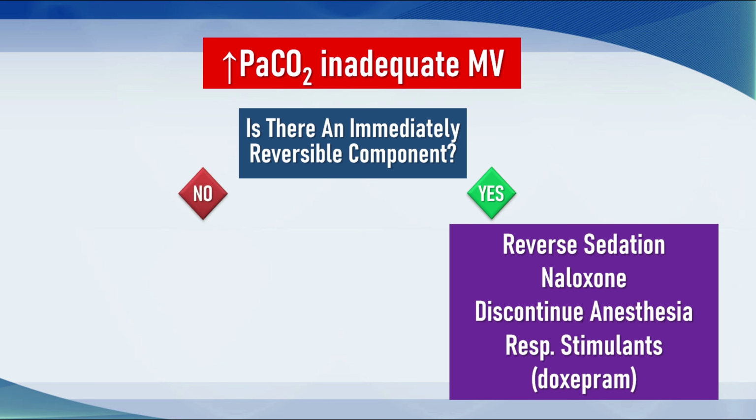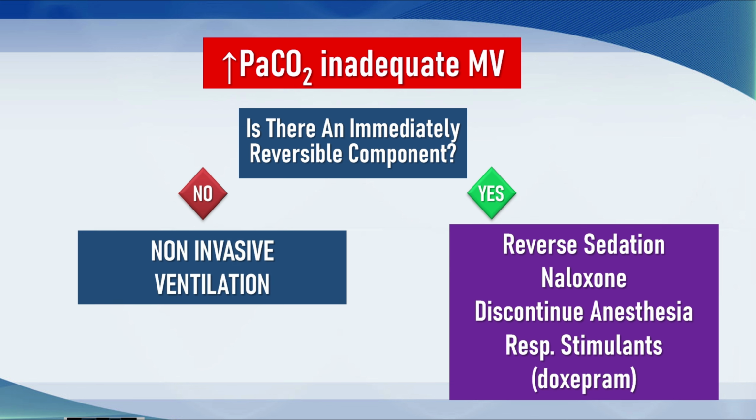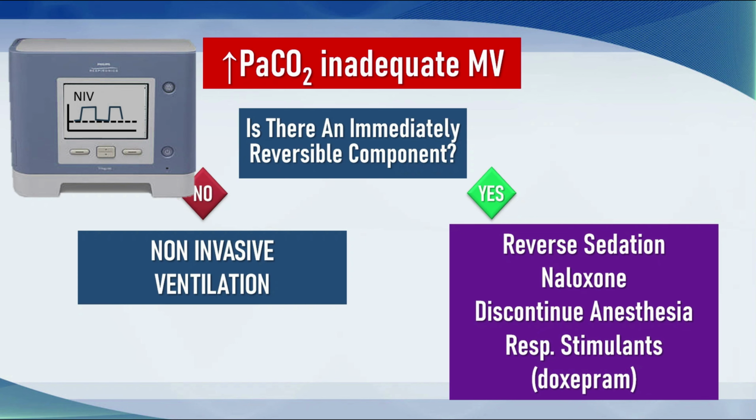If you cannot immediately reverse this, then you need to look at a strategy that will increase minute ventilation and alveolar ventilation for that patient. And often that is the use of non-invasive ventilation. This is a non-invasive ventilator.